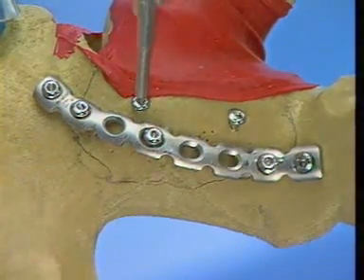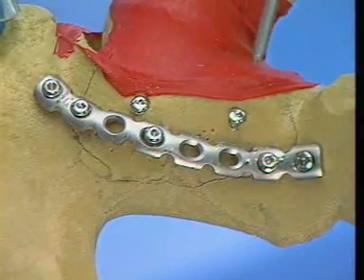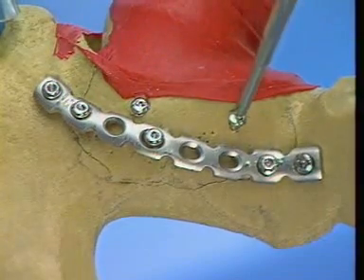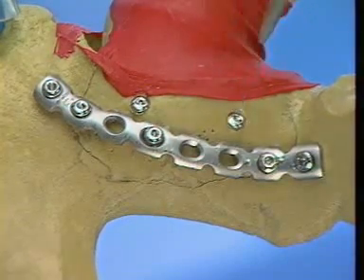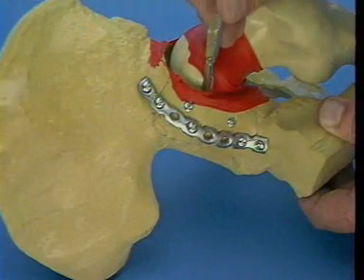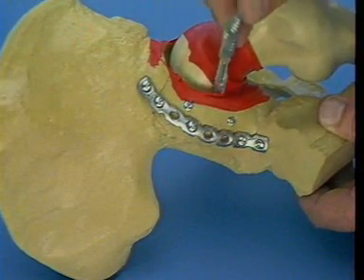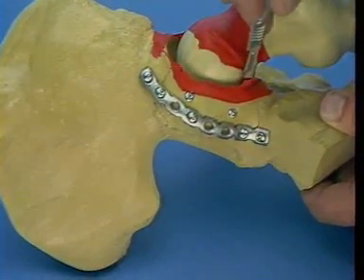The lag screws in the posterior wall may now be fully tightened if they have not been previously. The final reduction is typically not visualized because the hip capsule is left attached to the posterior fragments to preserve vascularity and hip stability. In our fracture model, however, we will now open the hip capsule to visualize the final reduction.